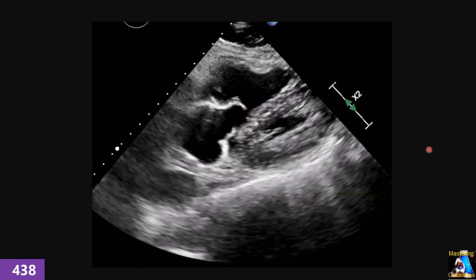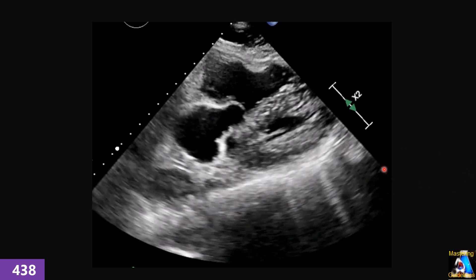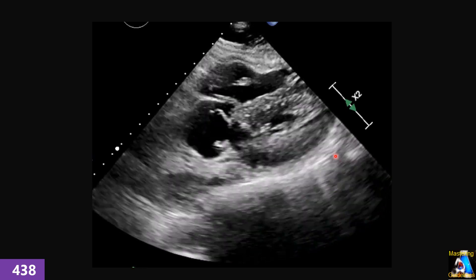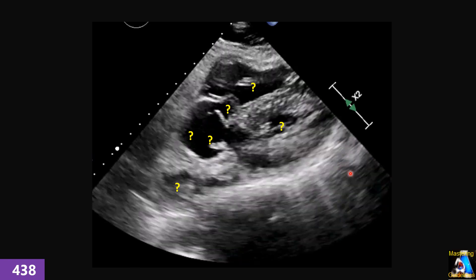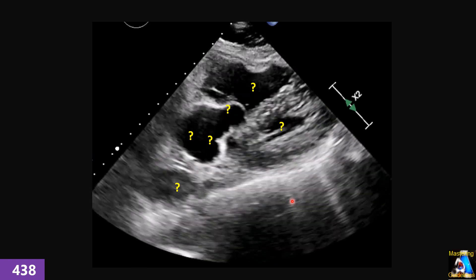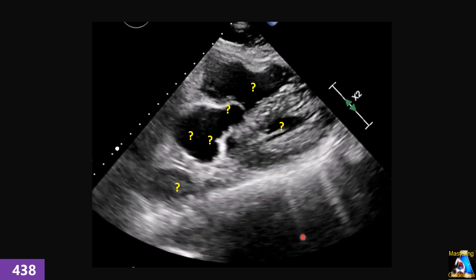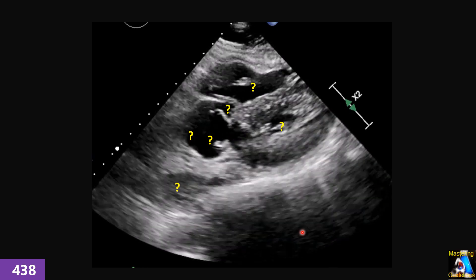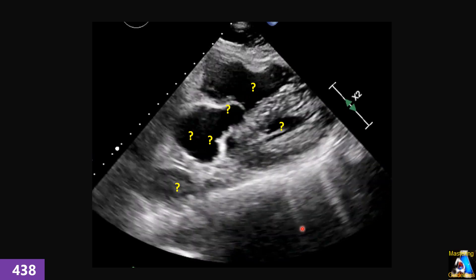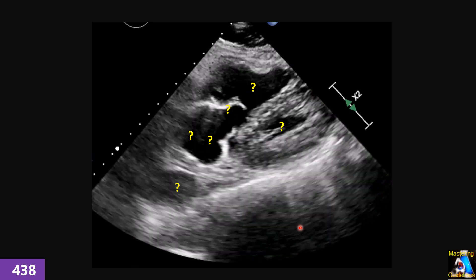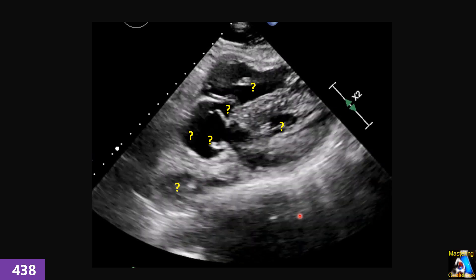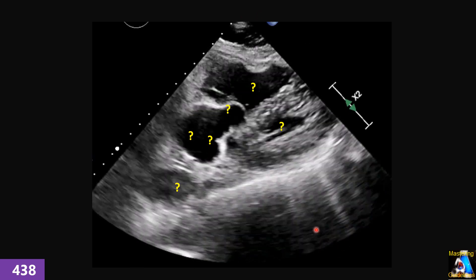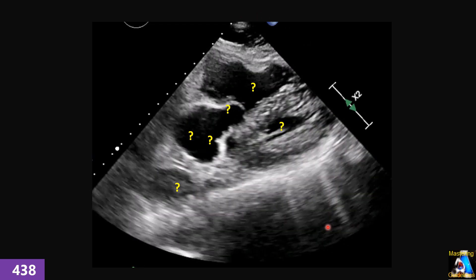Here we have another view. Which window is this? What are those structures? What is the abnormal finding in this case? Which view and window do we use to confirm that finding? And finally, what can we do in this window? This window appears to show a four-chamber view after optimization and correction.